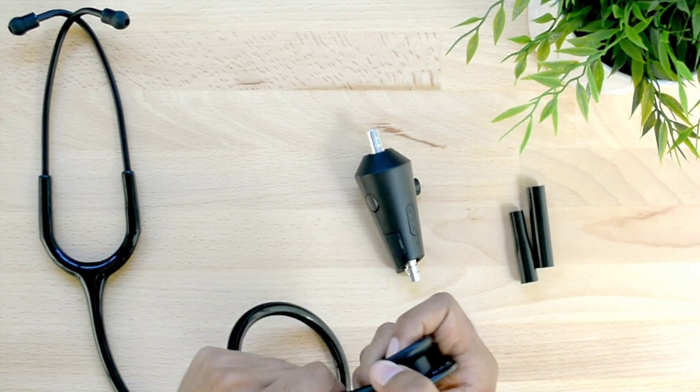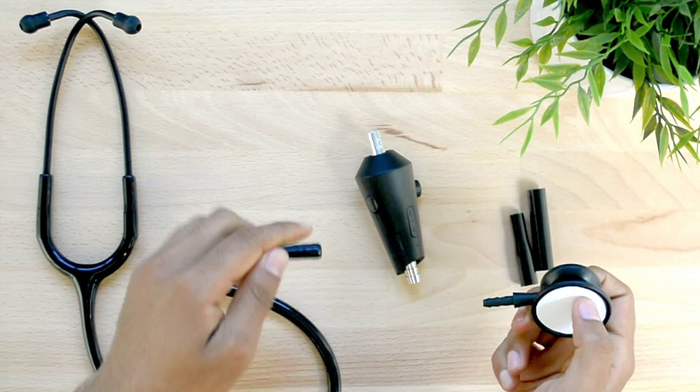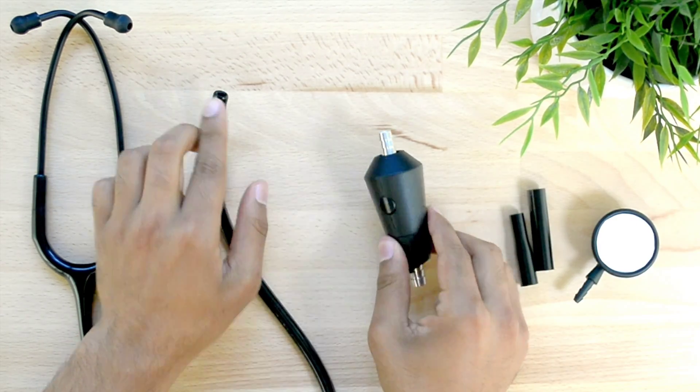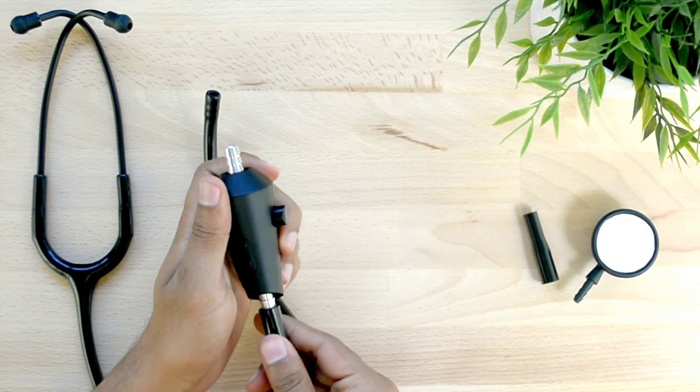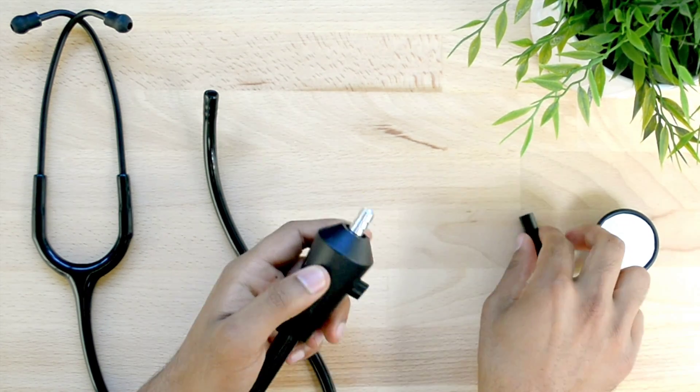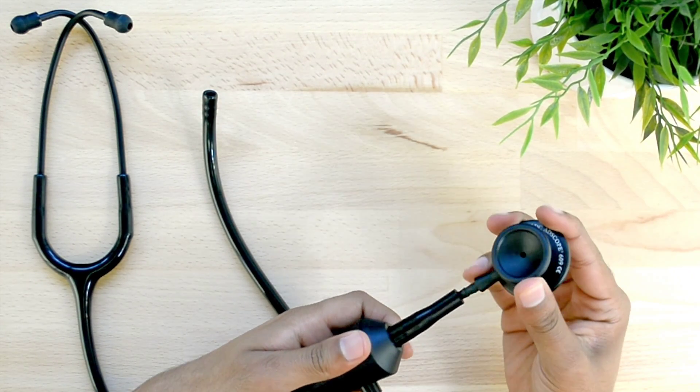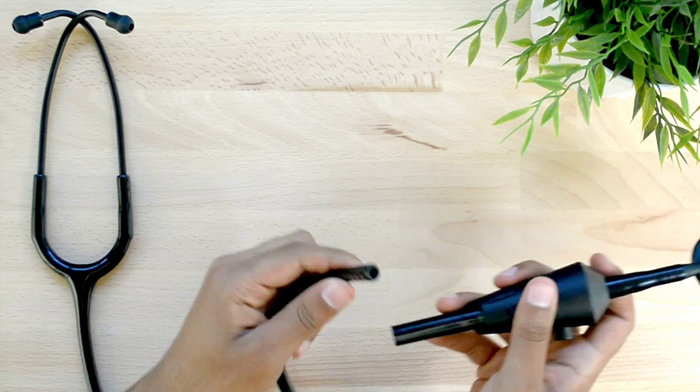First, remove the chest piece of the stethoscope. This may require some force. Then attach the large adapter to the bottom of the ECHO-Core and the small adapter to the top. Now press the chest piece into the small adapter and insert the stethoscope tubing into the large adapter.